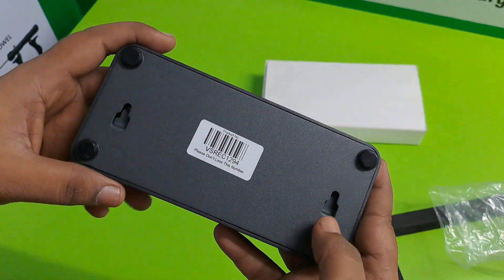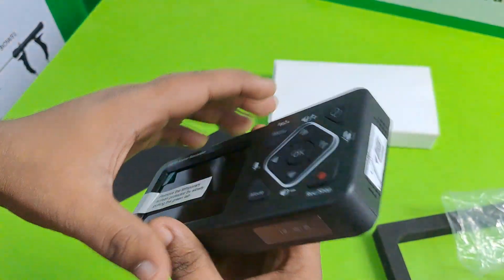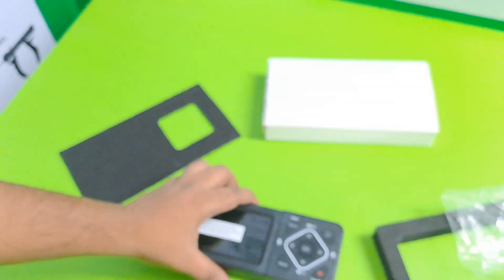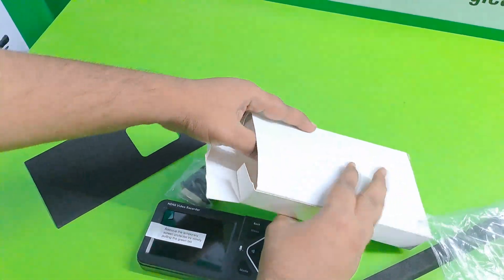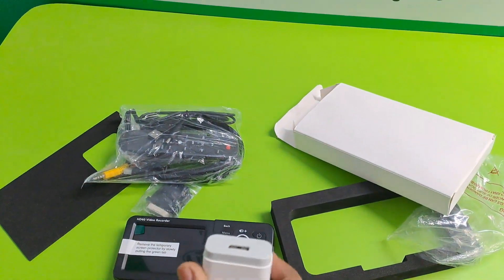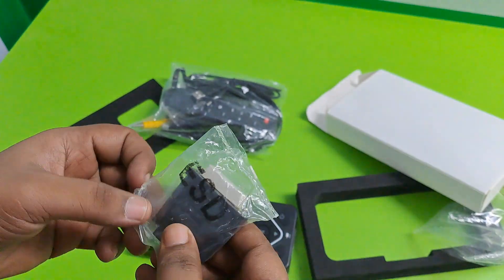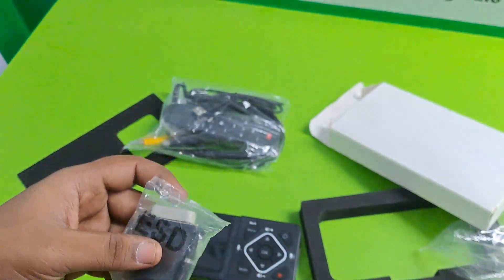There are stand position points. Now I am showing you how to connect this. This is the adapter. This is ESD. You can easily connect in PC.